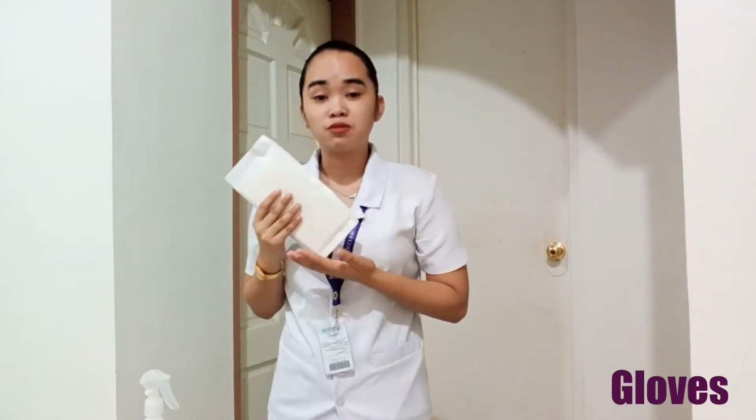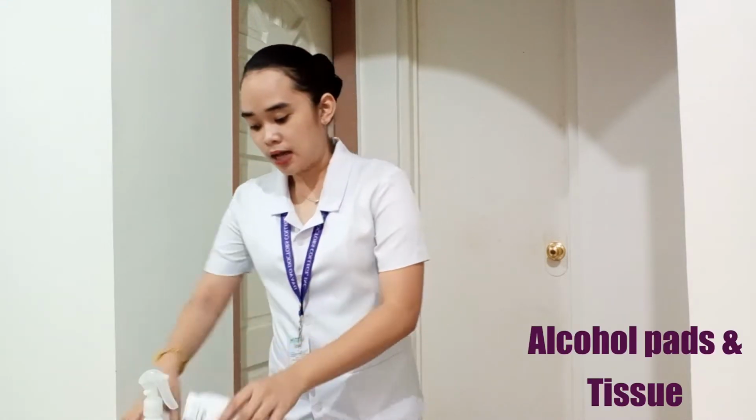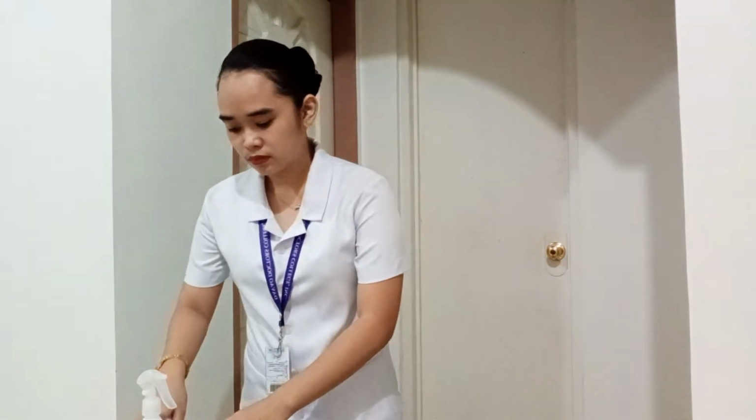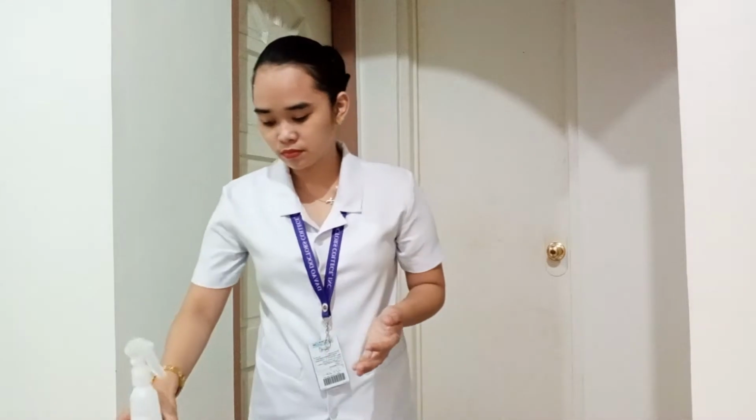gloves to protect our hands from cross-contamination, alcohol pads and a tissue for the disinfection of all of our equipment, and lastly, we have alcohol for hand hygiene and disinfection. So the organization and completeness of all the necessary equipment needed ensure our efficiency as student nurses. Now that we are all set, we can proceed to the assessment.